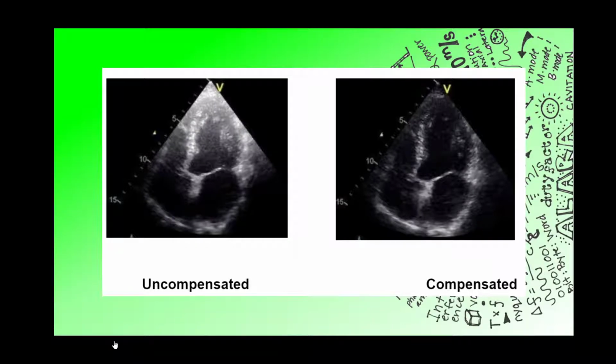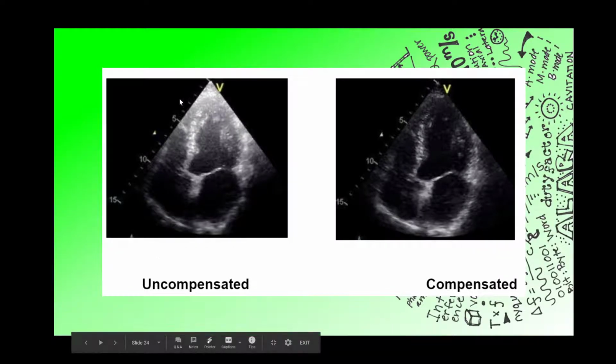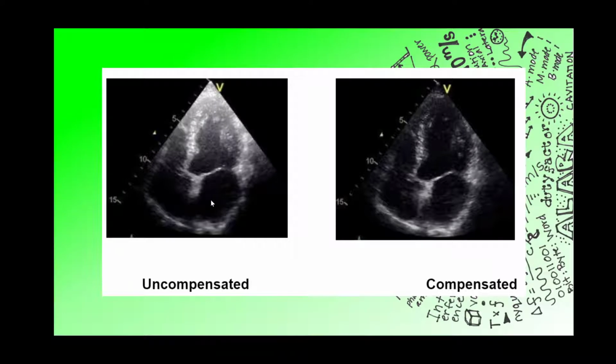So here is an example of an uncompensated view of the heart. Our signal is very strong up here. Remember, strong signals have brighter reflectors. And we know that the sound is attenuating as it propagates through the soft tissue, giving us that darker far field. When we compensate for attenuation, we can create a picture that is even all the way through. This is much more pleasing to look at for the radiologist. This will also indicate, say there's a large tumor or myxoma in the heart, that would show up here because it's made of different tissue than what we have assigned to the rest of the tissue. So having a correctly compensated image also helps pathology to stand out better.